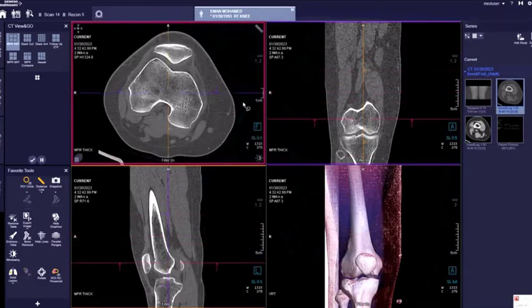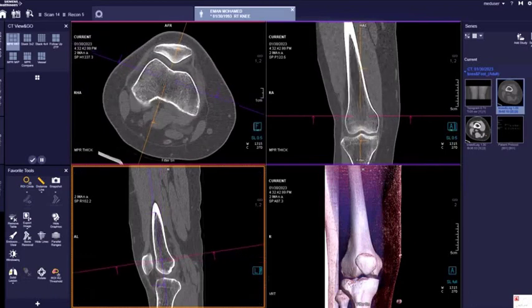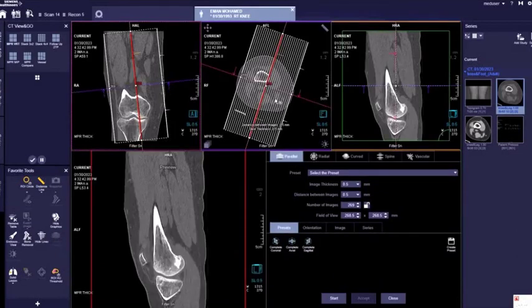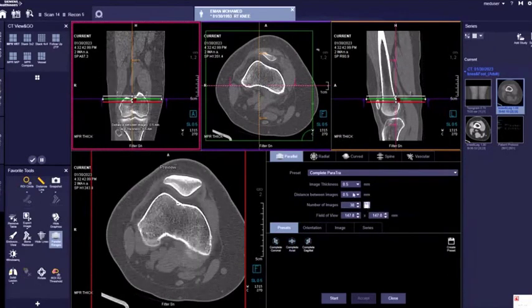Okay, I will press on the ranges. After that, make my knee right for the anatomical positions this way and this way, by ranges. First, I will cut axial. Press on the presets, axial, choose axial. This is axial, okay. After that, I make a reset for my image.